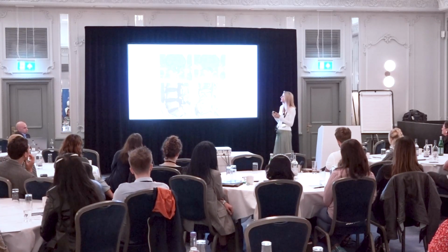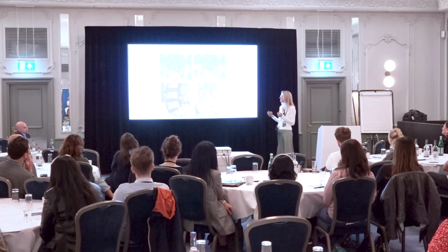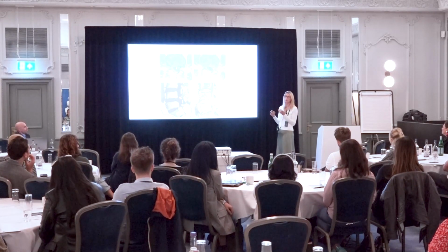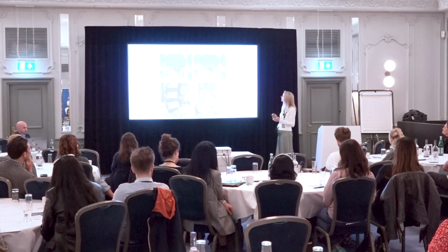If it's disc, it tends to enhance peripherally. But sometimes we'll sit together, neurosurgeons and neuroradiologists, looking at them and saying, not quite sure. So things aren't an exact science, but generally, peripheral enhancement means recurrent disc.